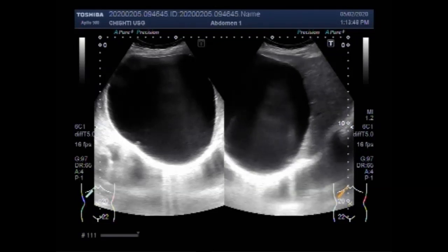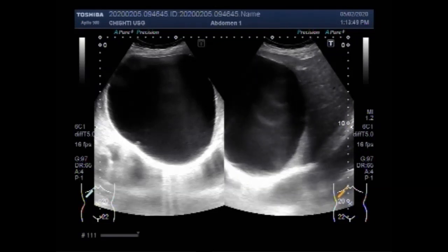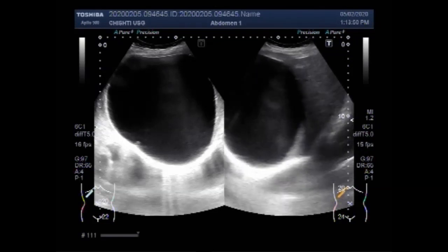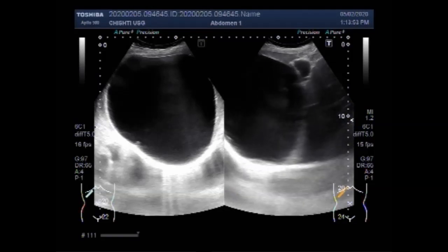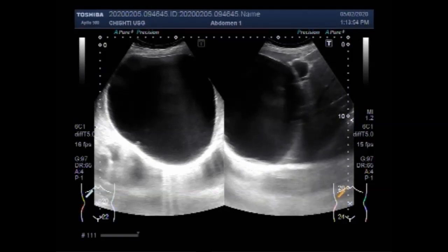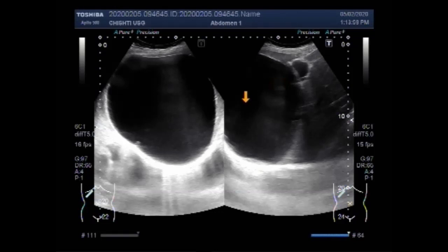You can see this cyst is very large and contains almost clear fluid in its interior. It is round to oval in shape.